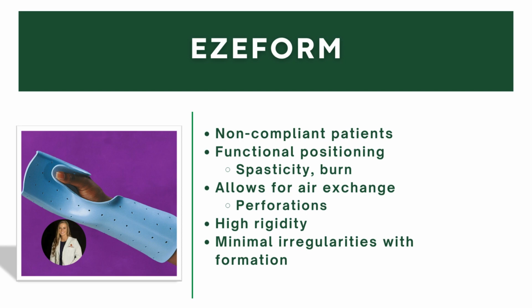It has really good and high rigidity, has minimal irregularities when molding with formation. So you don't need as many details. There are no fingerprints that are going to be present. And it's uncoated, so it's going to allow for permanent bonds, so that material sticking to itself, or self-adherence.